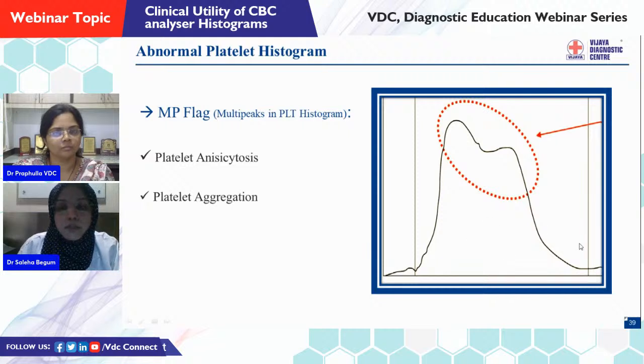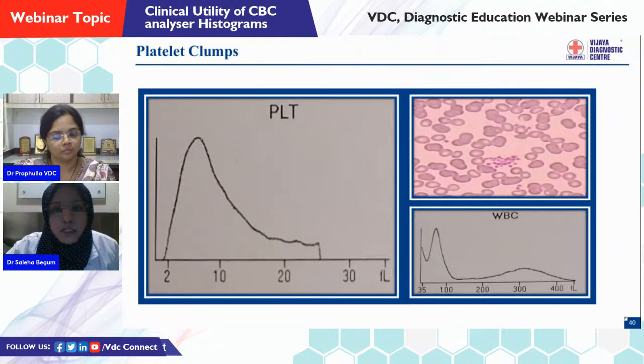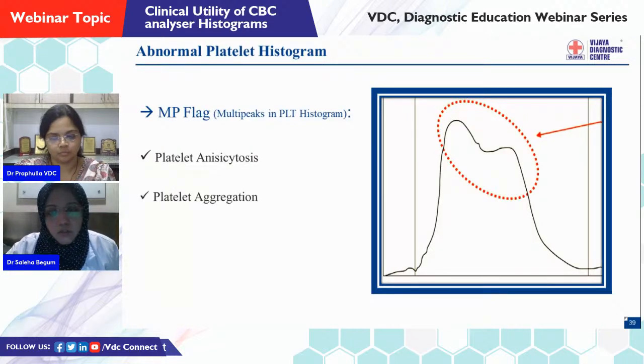Here you can see multiple peaks. The graph is showing two peaks, like what we have seen in the RBC histogram, that represented a dimorphic population. But in the case of a platelet histogram, it represents only platelet anisocytosis. Suppose there is destruction happening inside the patient's blood, platelet destruction happening, and simultaneous production of platelets, or maybe in cases of dengue fever infection, there is platelet transfusion. So that also creates such types of peaks. We have to keep that in mind. And apart from that, platelet aggregation also causes such types of graphs.